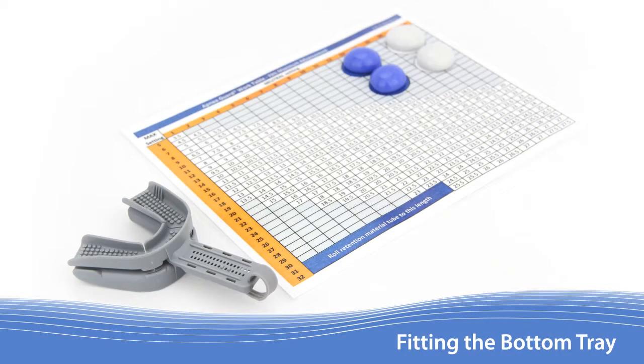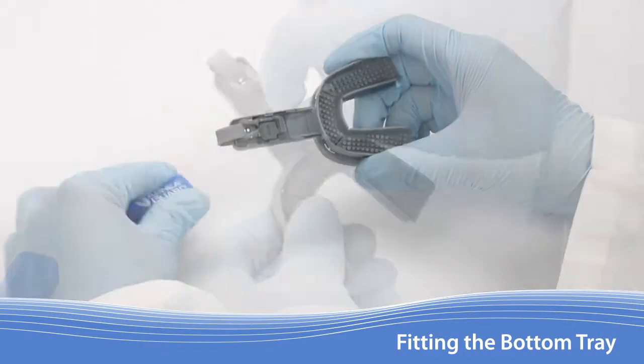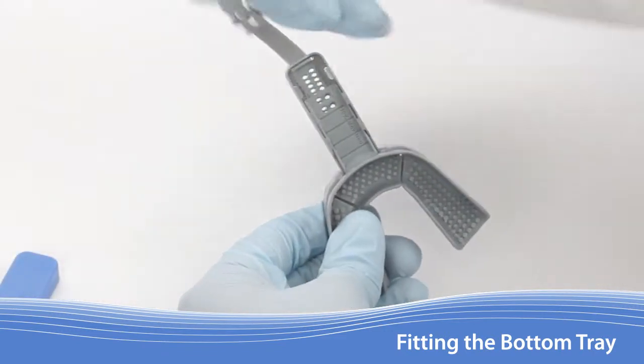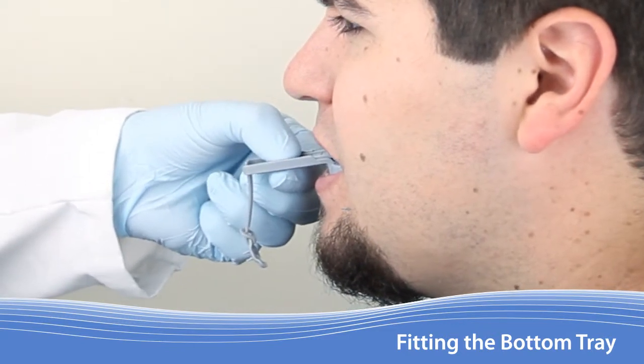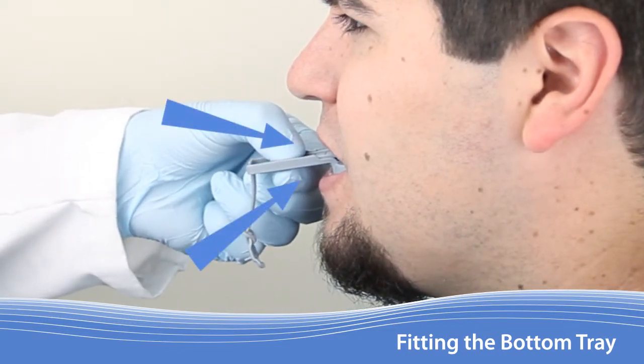The next step is to locate the patient's fitting setting. Have the patient rinse out their mouth if they have eaten since the last time they brushed their teeth. Begin by pulling off the lock cover. Lift up on the lock to remove it. Insert the Apnea Guard and press forward gently so both of the trays are snug against the front teeth.